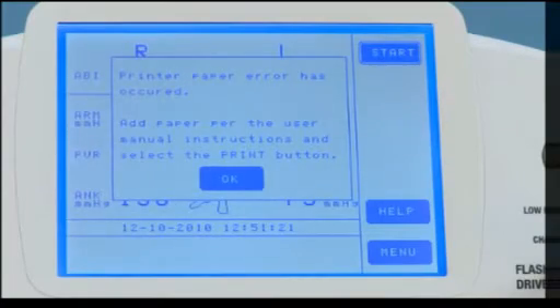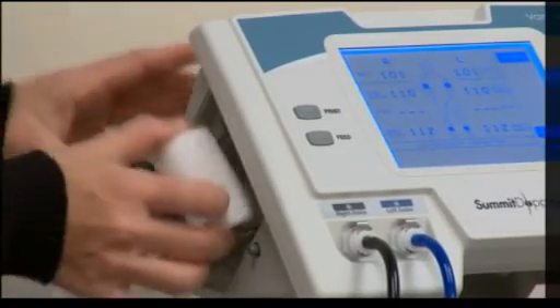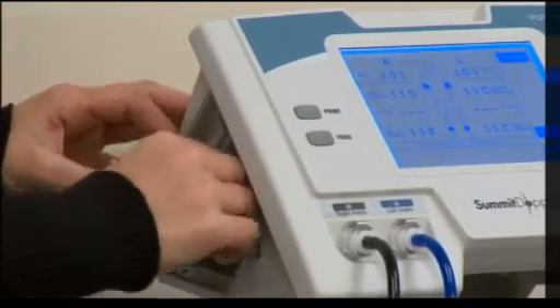If the built-in printer is out of paper or jammed, a pop-up warning will appear. If this occurs, follow the instructions provided in the user manual for adding and or replacing the paper.